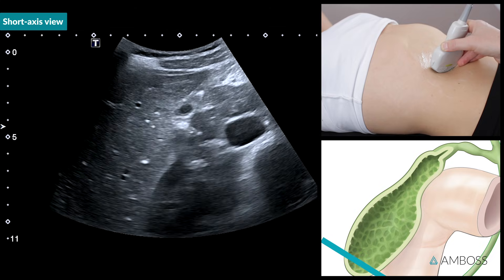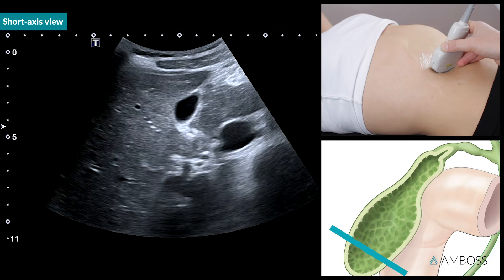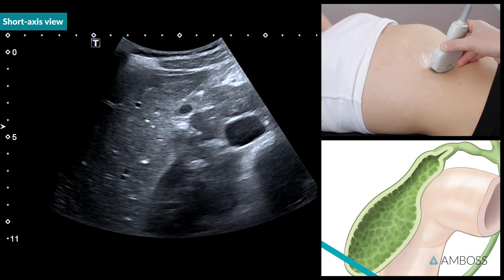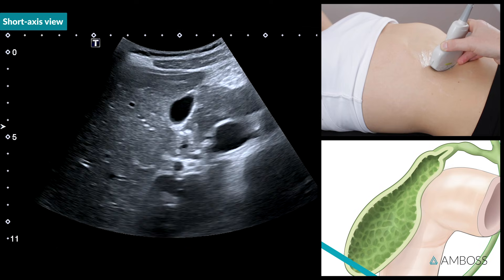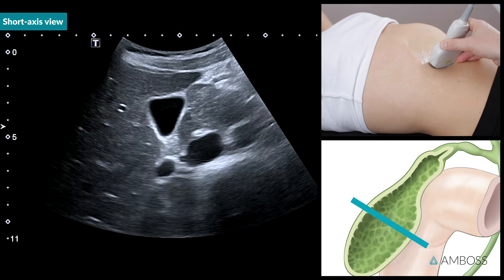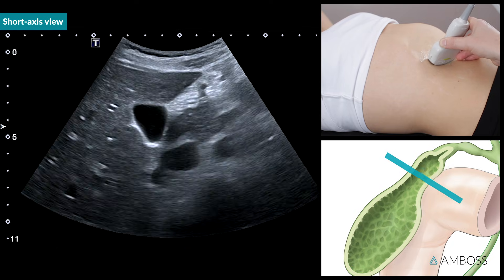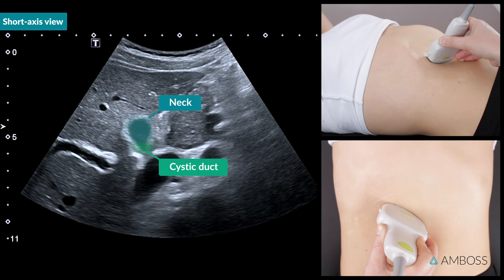First, slide toward the fundus until the gallbladder disappears completely. Then, slide in the opposite direction until the gallbladder neck and cystic duct are visible.